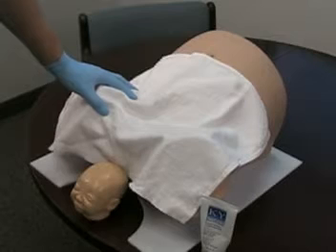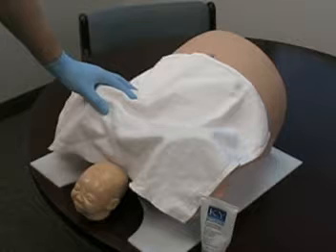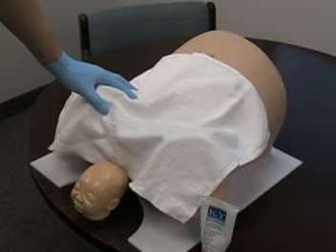I'll be focusing on three primary principles of vacuum-assisted delivery. Number one, position of the fetal head. Number two, proper placement of the vacuum cup over the flexion point. And number three, proper traction or delivering of the fetal head without inadvertent detachment or pop-offs.